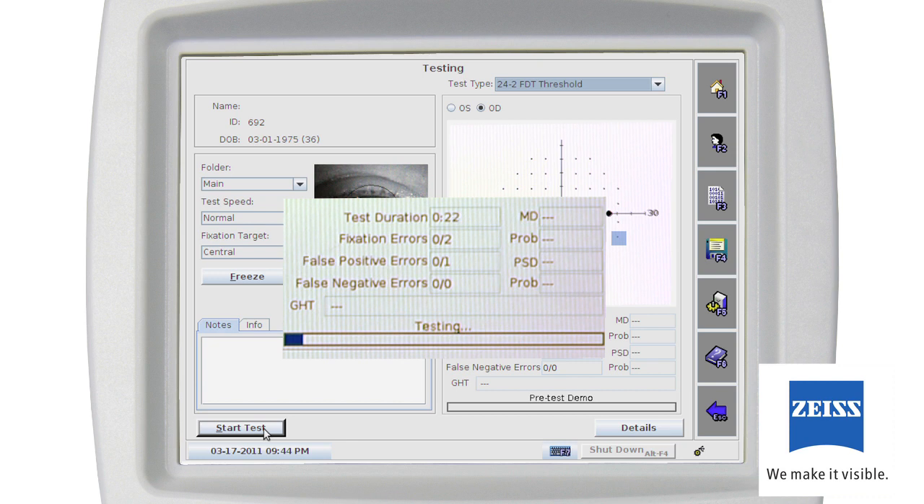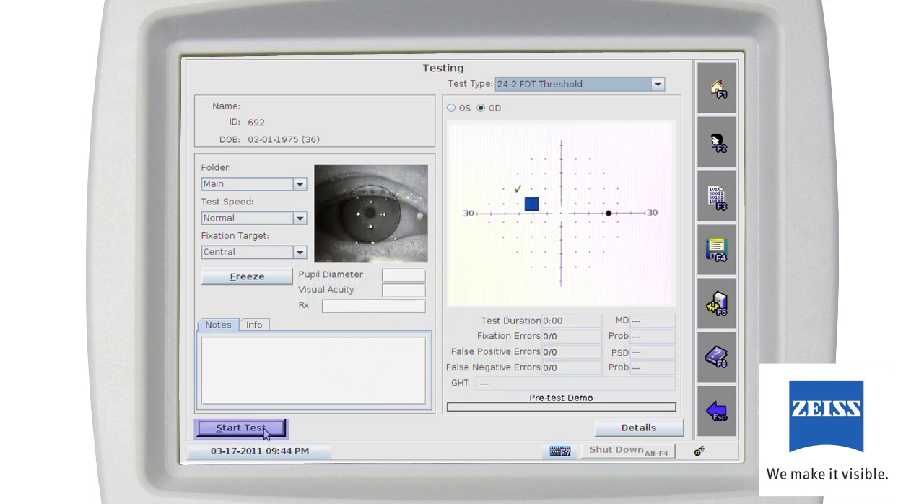You may need to restart or repeat the test if proper fixation wasn't maintained. More than 30% false positives will also generate a red warning — the patient is responding when no target is presented. More than 30% false negatives will generate a warning as well; in this case, the patient isn't responding to a very bright pattern in an area where they previously responded. You may pause the test at any time by pressing pause or the enter key on the keypad, then press resume to continue. You can also cancel the test at any point. You can fill in the notes field at any time.